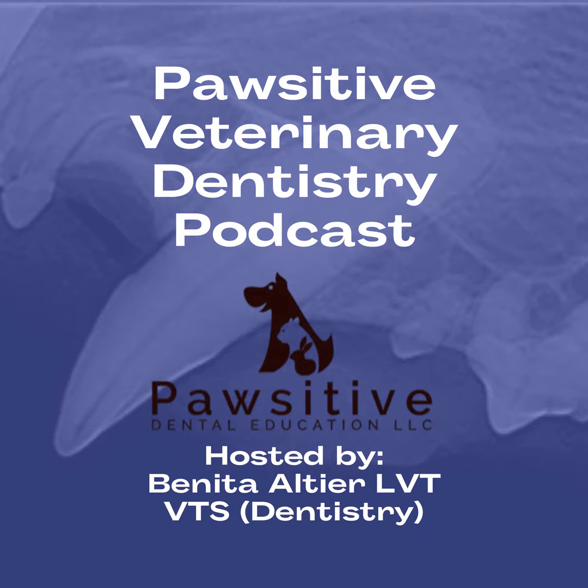If it's external replacement resorption where the root itself looks fused to the surrounding bone and it hasn't yet encroached onto the clinical surface or above the gingival margin, I have a tendency to play it a little more conservatively and just tell the owner, yes, this patient has tooth resorption, but until it encroaches onto the cemento-enamel junction or the crown of the tooth, I am more apt to monitor conservatively, because at this point we don't necessarily know if those patients are uncomfortable or if it is something that is actually going to progress into the loss of the tooth.